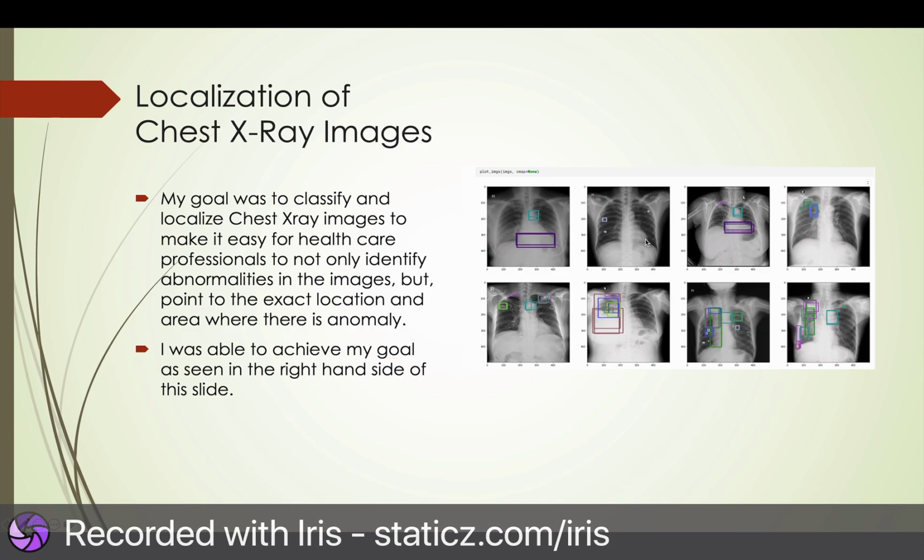So when you look at this, we also have some minor abnormalities identified here. We also have this one which has seemingly two or three, but it seems like we also have several radiologists or physicians who are able to diagnose or identify this as an abnormality. The same for this. And this one now, it seems like it has more than three abnormalities.